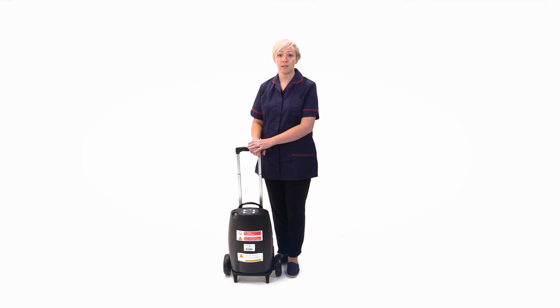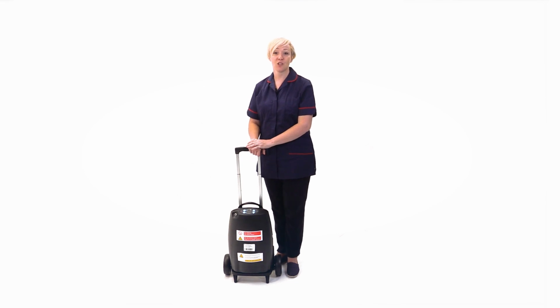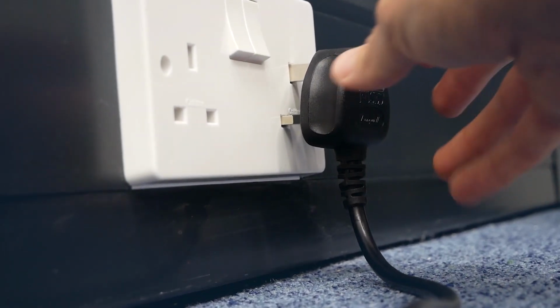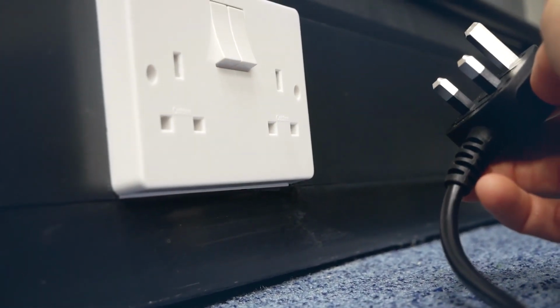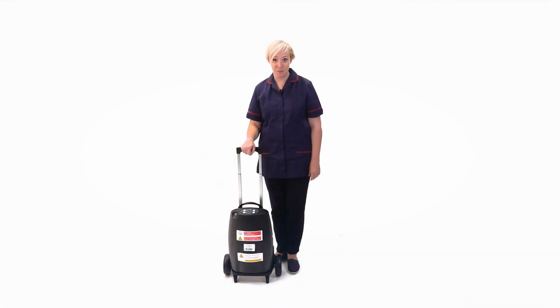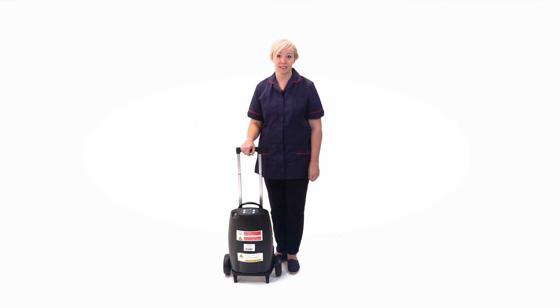If you have no power, it is possible that the battery is not installed properly, so install the battery or plug into an external power source. Or it could be that the battery is discharged or no external power is present, so plug into an external power supply. It could also be that the AC or DC power supply is not plugged in correctly, so you should check the plug at the outlet, power supply box, and if the device is itself to ensure it's properly plugged in.